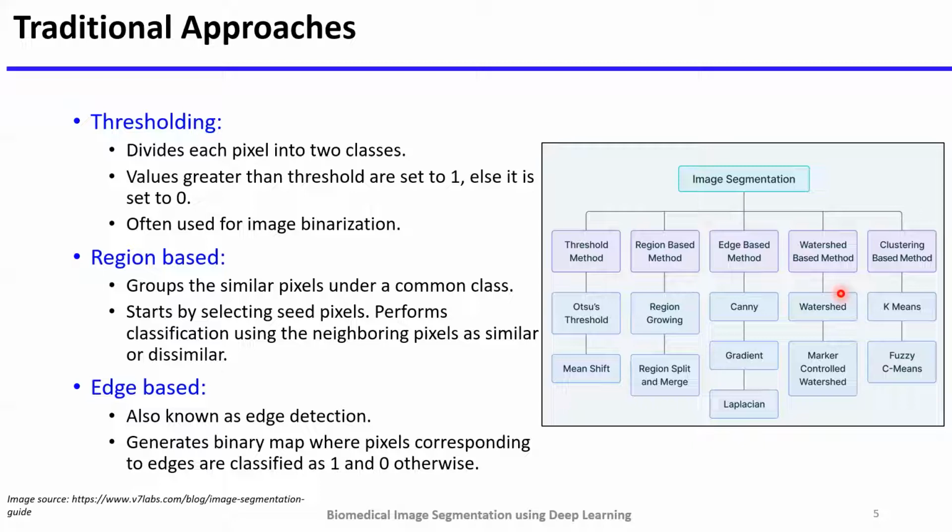Typically, the segmentation procedure starts with some pixels set as seed pixels, and the algorithm works by detecting the immediate boundaries of the seed pixels and classifying them as similar or dissimilar. The intermediate neighbors are then treated as seeds, and these steps are repeated until the entire image is segmented.